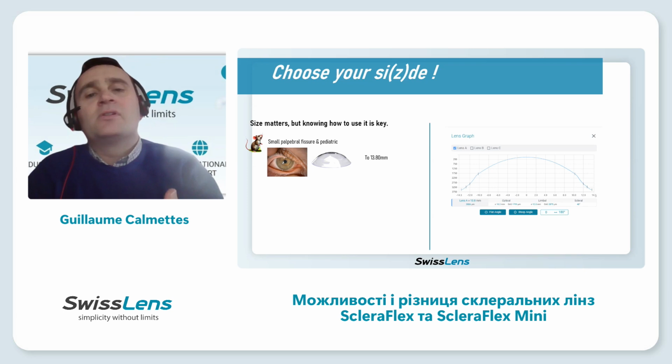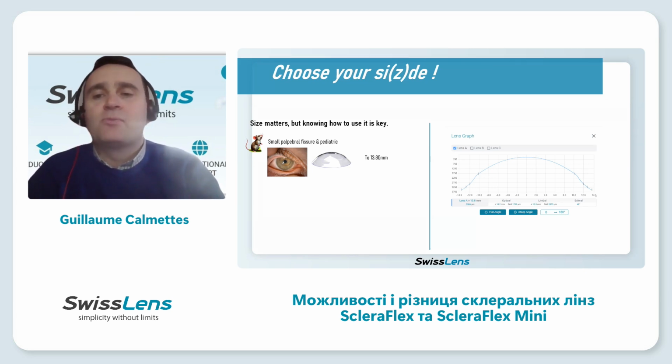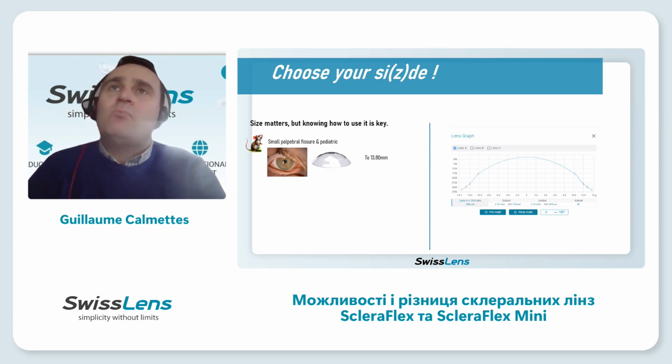If you can choose a scleral lens with a very small diameter, 13.8, which is the minimum for us, it's easier, and the patient can be happier to see that he can wear a lens.